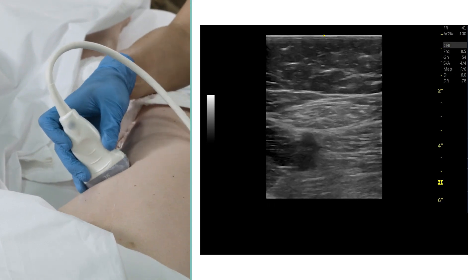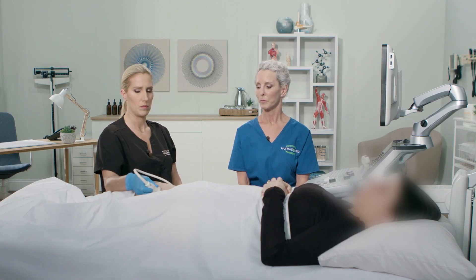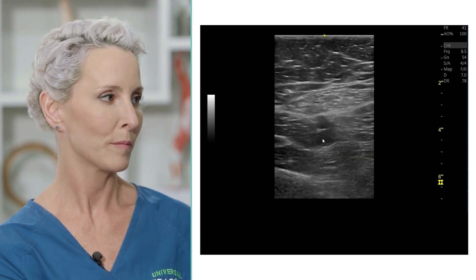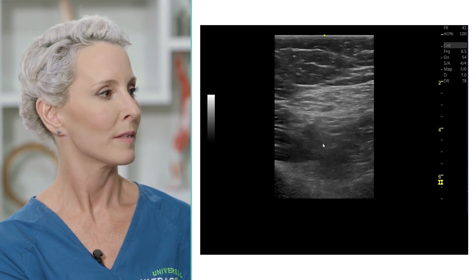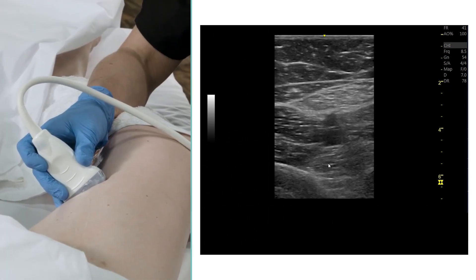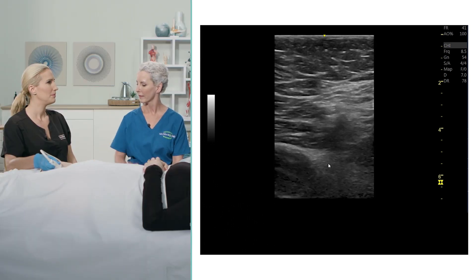As she scans down to the distal section of the thigh, the transducer position becomes more posteromedial. Pointing out the femoral vein on the bottom and the artery on the top, it looks like there's difficulty visualizing the femoral vein in this part of the leg.